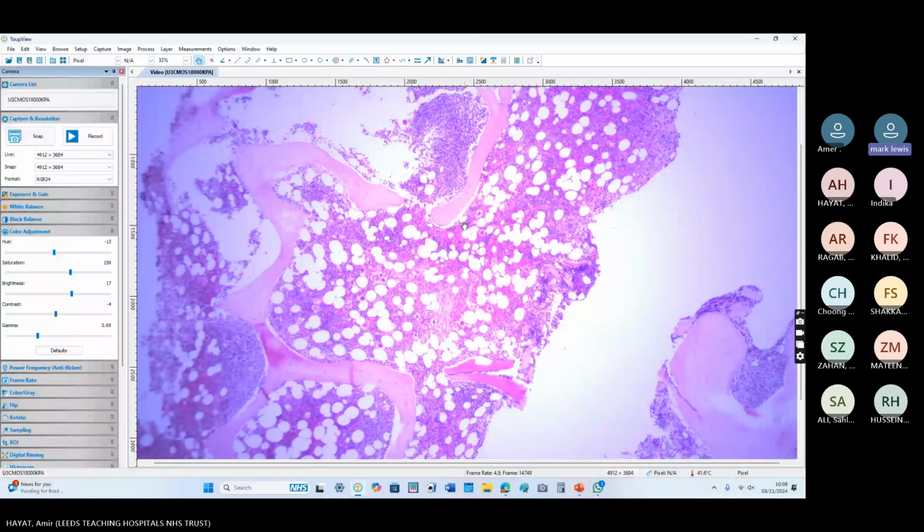I'd like to see bone marrows more, to be honest. But the problem is that it's very difficult to bring out the trephine. Aspirate, we ask the BMS, they make a slide for us, but trephine is very difficult to bring out from FMB. This slide is given to me by my friend. Yeah, histology is given straight to the consultants. We don't see these in hematology.